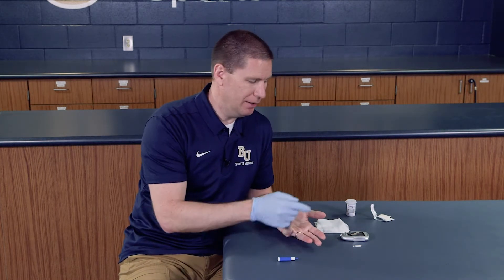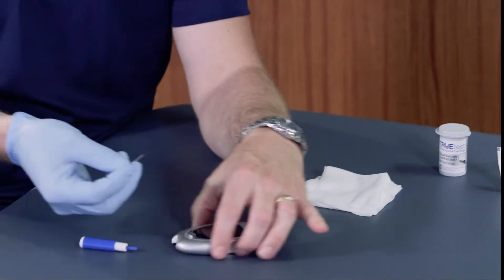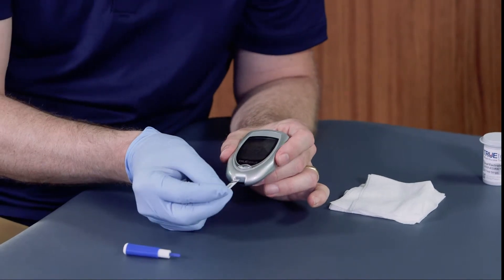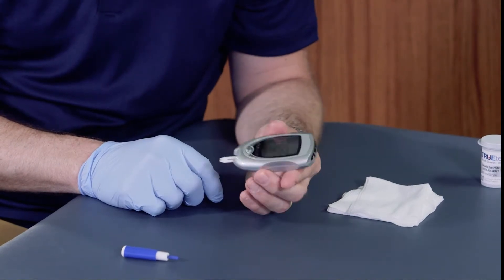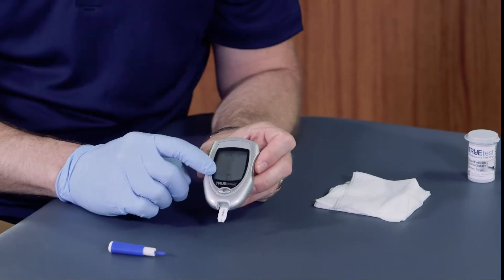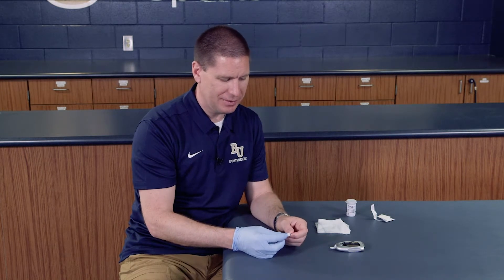Now what I need to do is draw a small amount of blood to be able to get my reading. I'm going to take the blood glucose meter and slide the test strip directly in so that way it's all set and ready to go. I'll wait for it to read — it has a mark that says it's ready for blood.